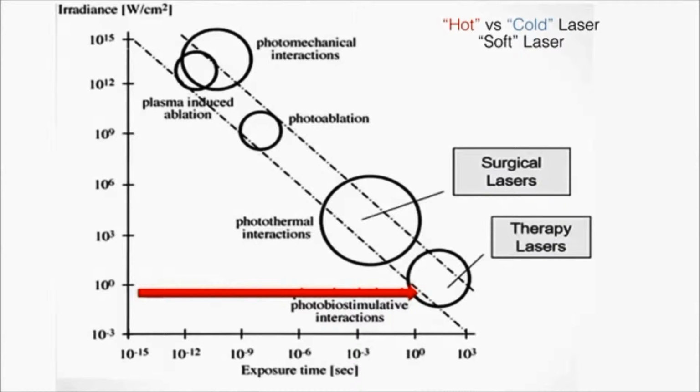Can we keep the slide up, please? And if you go further and further over, you can actually ablate tissue. So on these FDA and CE markings, we have to prove safety, and that within the parameters of a laser that's allowed to be used for therapy, we are in this therapeutic zone and not getting to the surgical zone. But changing the spot size and changing the power or the time it's on can have that detrimental effect. Hence, only selling it into the medical profession.